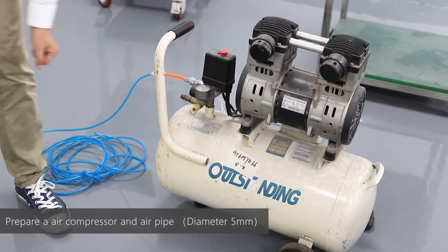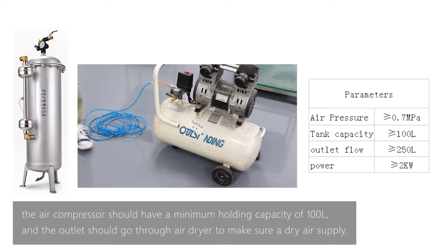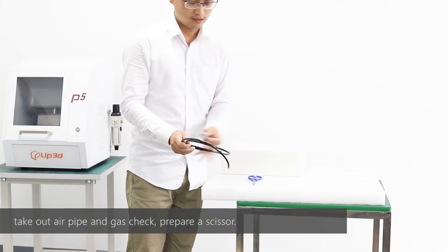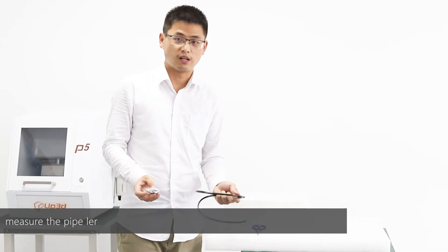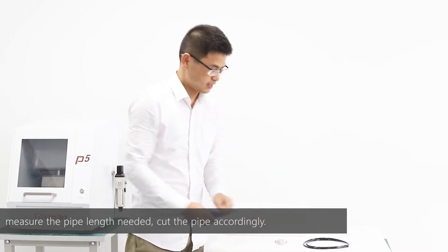Prepare an air compressor and air pipe. The air compressor should have a minimum holding capacity of 100 liters, and the outlet should go through an air dryer to ensure a dry air supply. Prepare scissors to cut the proper pipeline. Connect the right outlet on the regulator to the mill and the left outlet to the gas check.